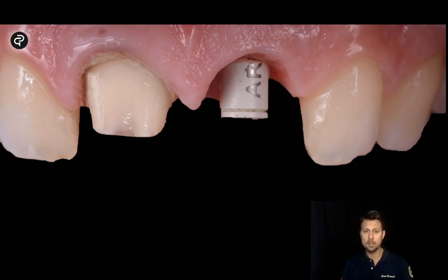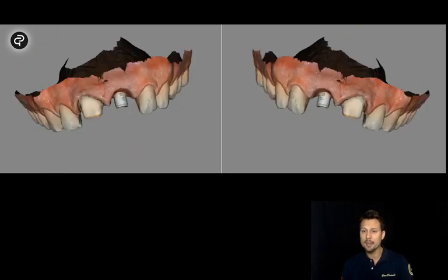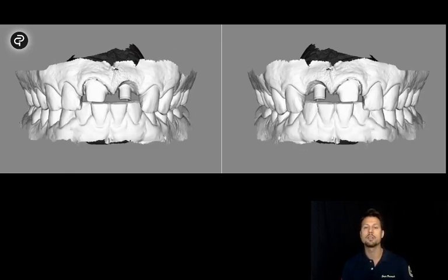So this is what we did. We performed a scanning in this case, and we had as a result an STL file that we can send to everybody just with an email. You don't need to deliver your impression material and your occlusion anymore, you just send an email wherever you want in the world, and that's really important for me because I can work with quality with the technician at either side and in a really fast way. It's even easier to communicate.